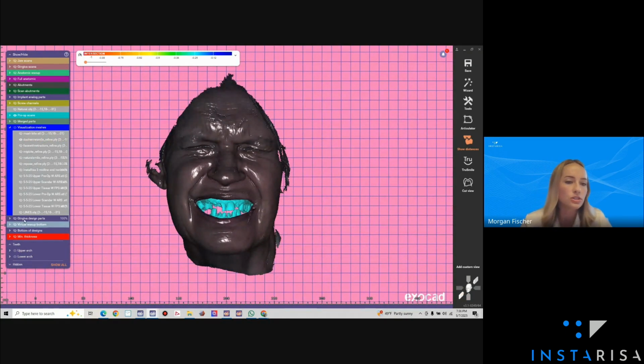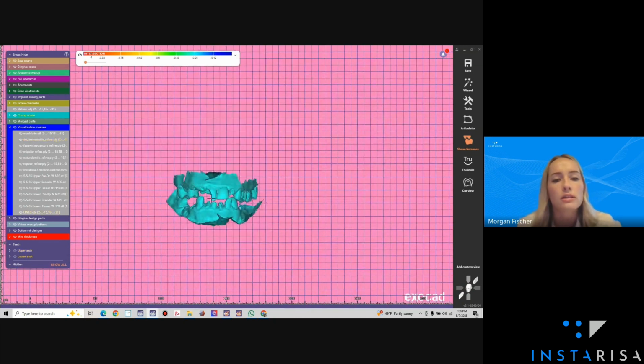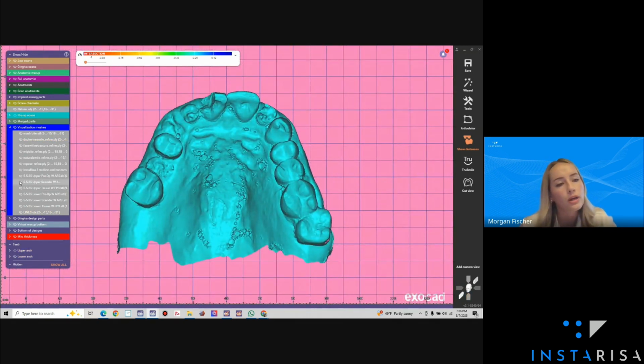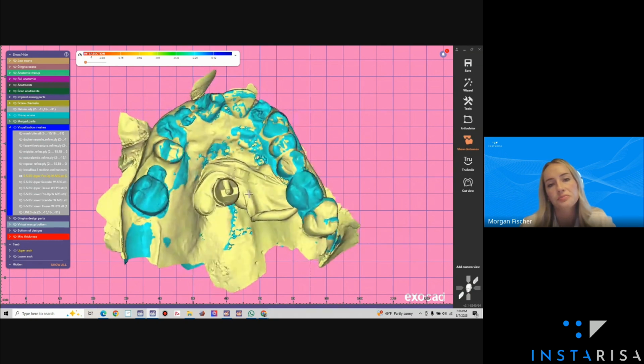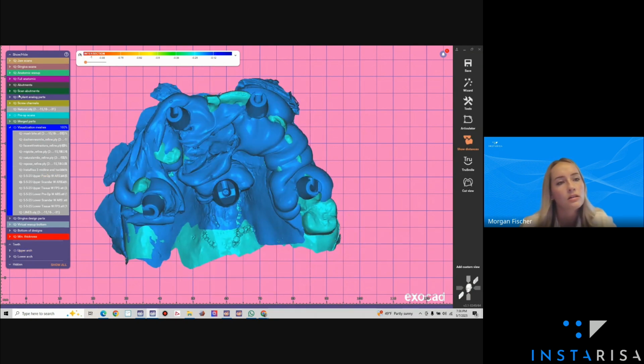So this is the patient in Duchenne. We have the lines going through the face. There's our anatomic wax up. Peter did a great job on this. And so on the day of surgery, we have our pre-op. They sent over records for the upper pre-op with Scandar. So it's going to look like this. Then they sent the Scandar.